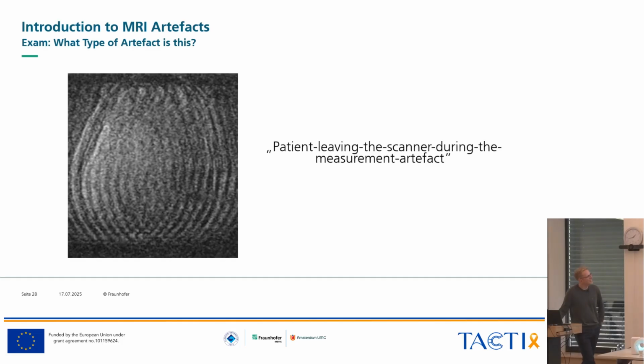Yes, that's the patient leaving the scanner during the measurement artifact. That was a subject who, I think, was confused, or maybe had some dementia-related problem. So yeah, the person really left the scanner during the scans. So of course, nothing really useful was measured there. All right, so that's basically it.